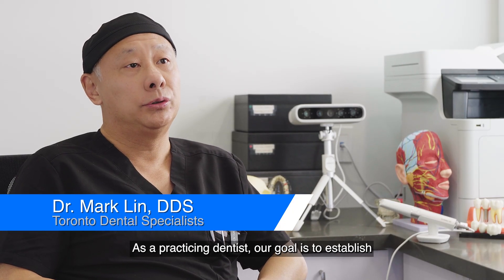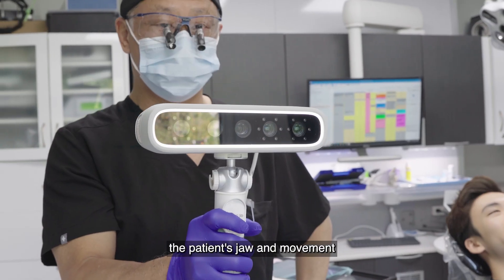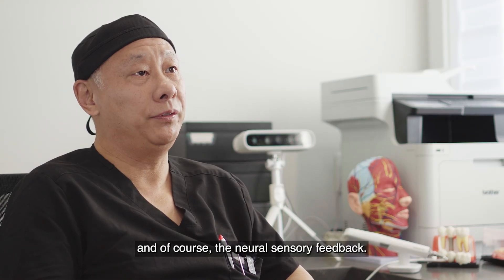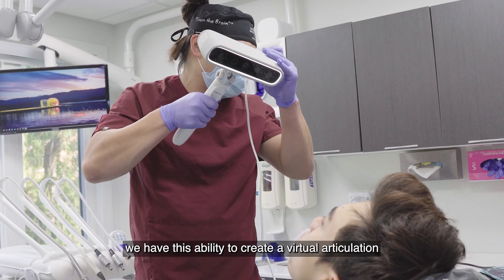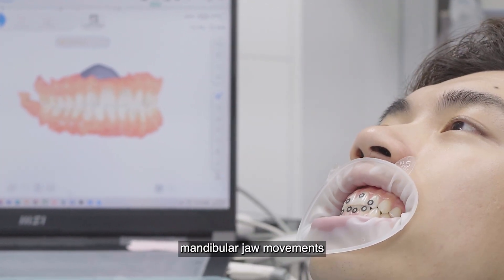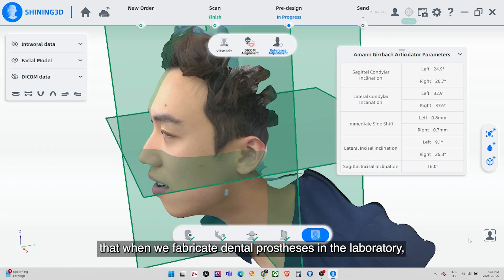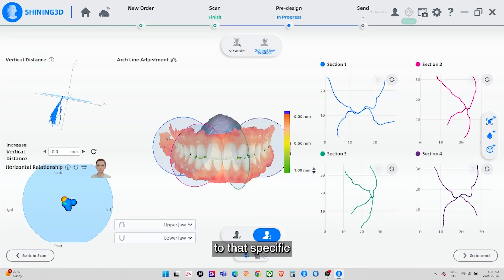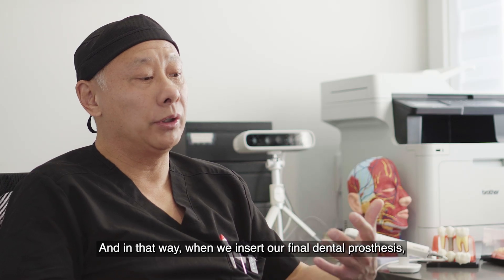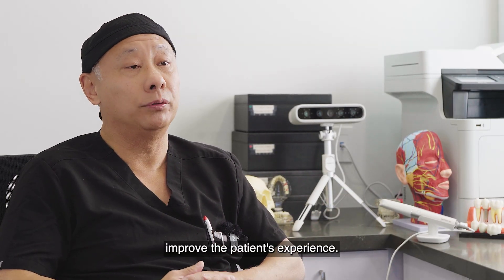As a practicing dentist, our goal is to establish a patient's articulation and occlusion. It's been said the best articulator is actually the patient's jaw and movement, because it encompasses the temporomandibular joint, the muscles, and of course the neurosensory feedback. With the MediSmile MR we have the ability to create a virtual articulation and, more importantly, give us very dynamic mandibular jaw movements — protrusive and lateral excursive movements — which means that when we fabricate dental prostheses in the laboratory, it's a lot more accurate and precise. When we insert our final dental prosthesis, there should be little to no adjustments of our final restorations, which will improve the patient's experience.